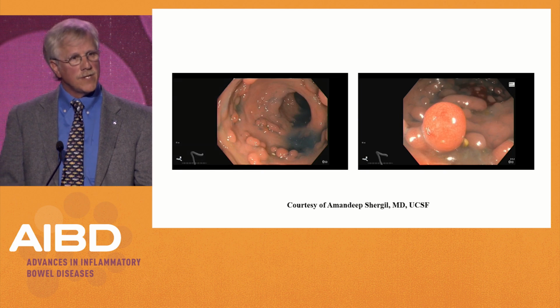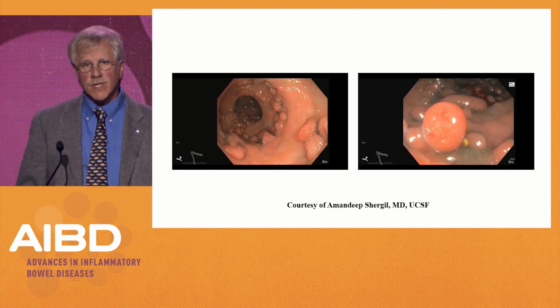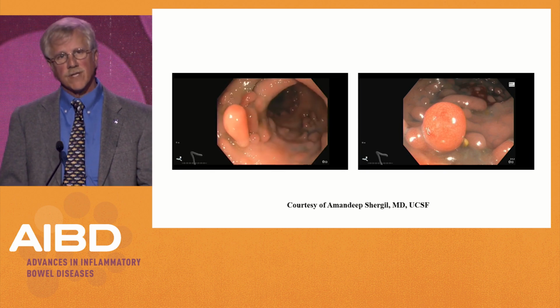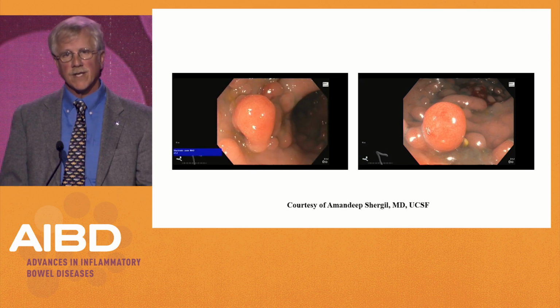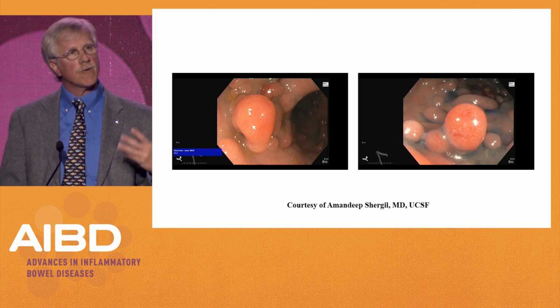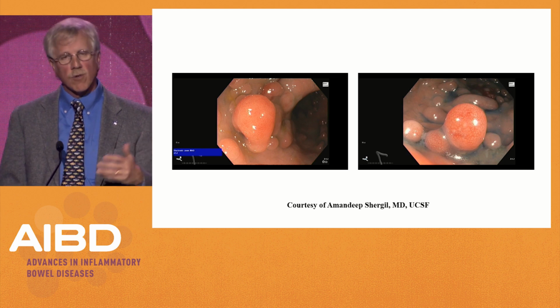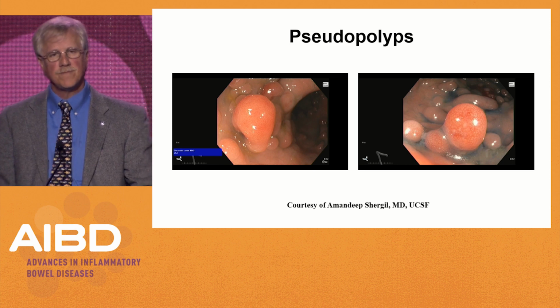Now, this is in contrast, a patient with multiple pseudopolyps. I certainly recognize that this can be difficult, like looking for the needle in the haystack. Again, there's a polyp that the endoscopist identified. You can then spray this colon, and again, you'll be looking for an area that sits out or basically looks like a sore thumb. And when you really look at this colon, I think you can be comfortable that these are all pseudopolyps.